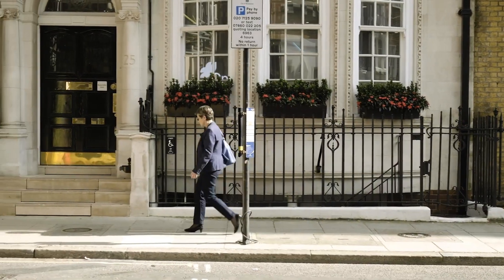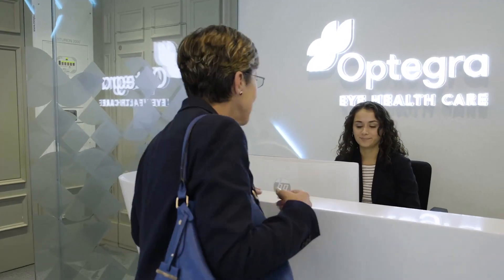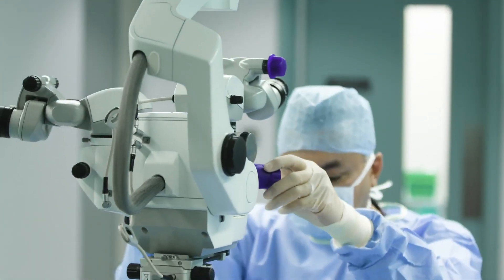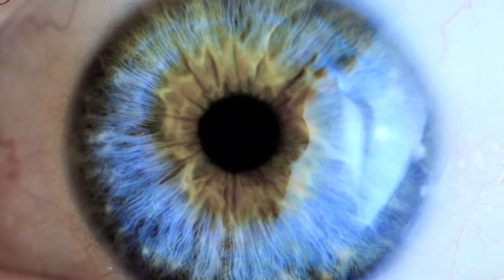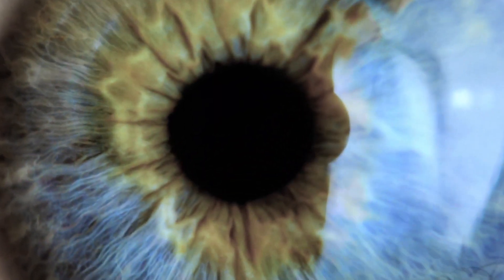Many of the patients that come to see me are affected by visually significant cataract or significant refractive error. One of the great privileges of being an eye surgeon is being able to either enhance or maintain someone's quality of life.